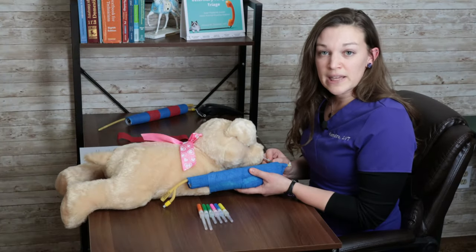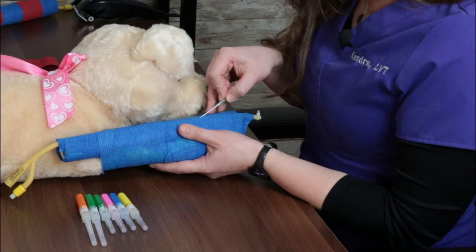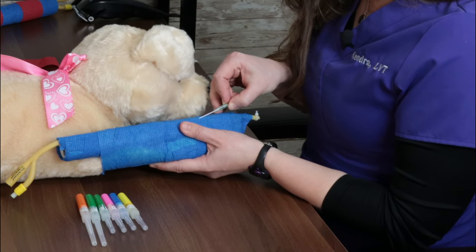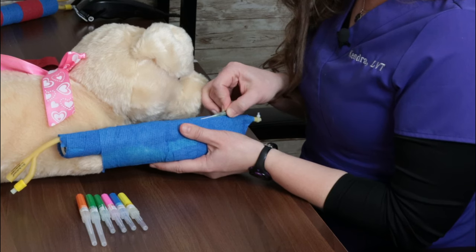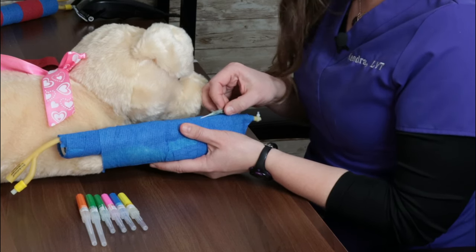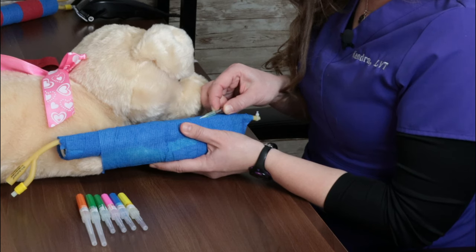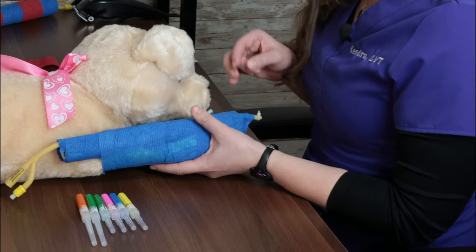All right, let's go ahead and place this IV catheter into patient Penelope. So we're gonna take a pretty shallow angle for our small animal patients. We're gonna go ahead and be assertive and push through the skin and the vein. Decrease our angle and advance a hair more to make sure our catheter made it in. We'll go over that more later. And then hold our stylet still and advance our IV catheter into the patient. We're gonna advance it all the way up to the hub and then remove our stylet.